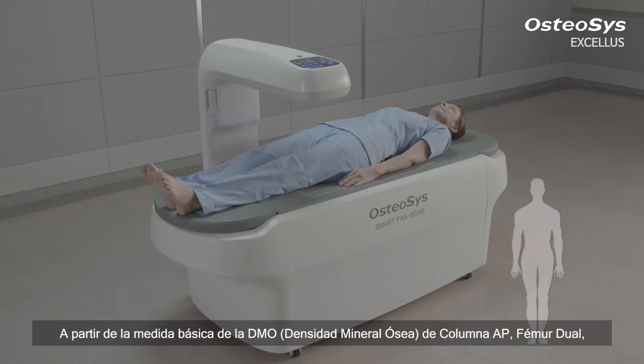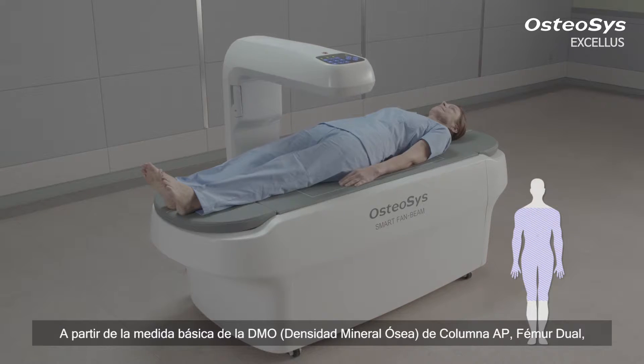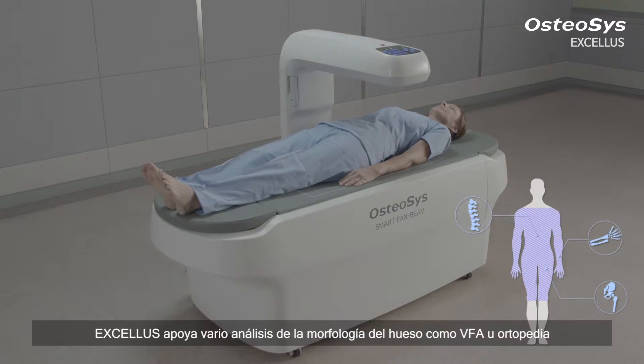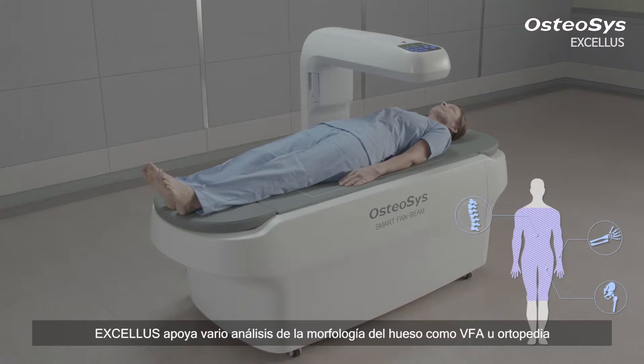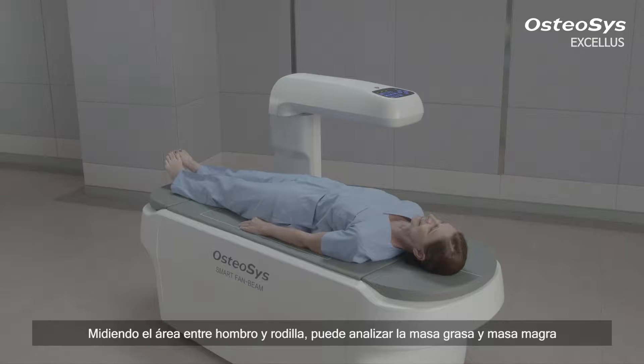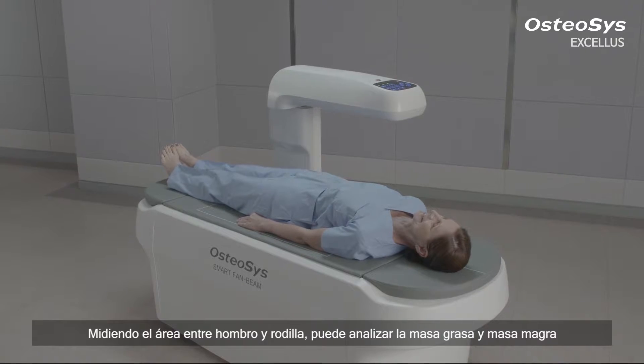From the basic measurement of the BMD of AP spine, dual femur, forearm, and lateral spine, EXCELLUS supports various bone morphology analyses such as VFA or orthopedics.